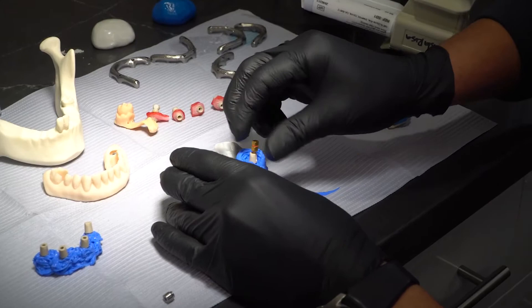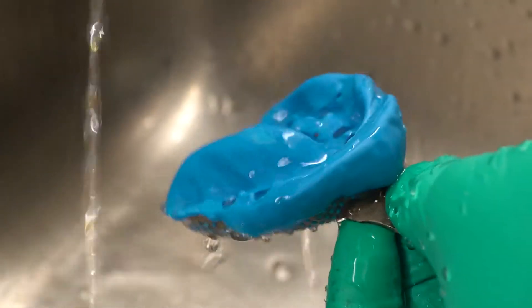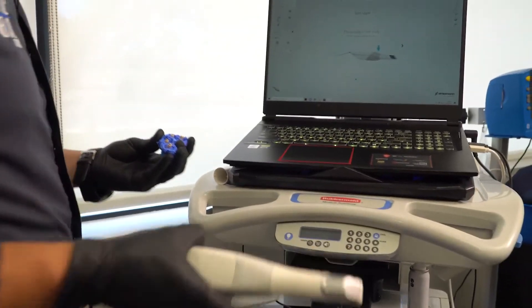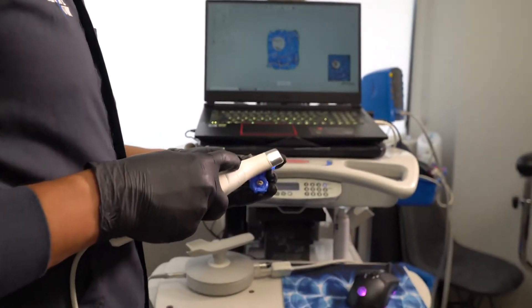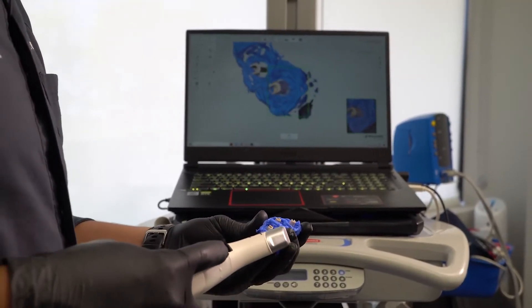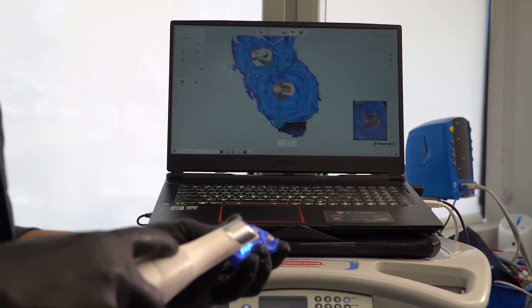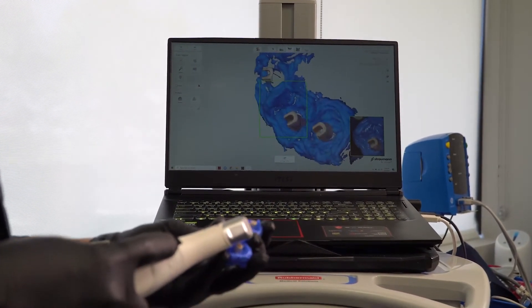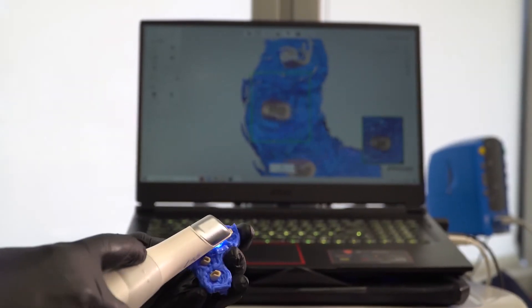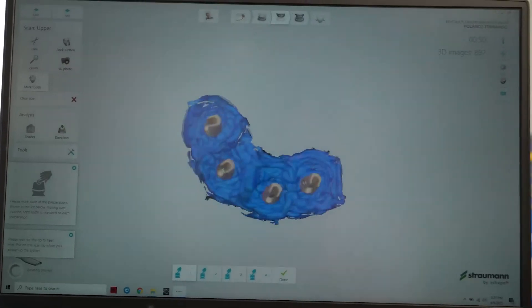Once the material is hard, we make sure that everything is sealed and then we can start removing everything. Now we have the option to scan with a desktop scanner or with your intraoral scanner. I get an air-water syringe and dry this — I want to make sure I don't drop it or squish it. I get my intraoral scanner and follow a path going occlusal, occlusal, occlusal. I never start from the lingual or buccal. Once I capture my occlusal position I leave the scanner there for 2-3 seconds, then move to the other scan body: buccal, distal, lingual, mesial. Then back to the previous scan body: buccal, lingual, distal, mesial. We don't want to be fast — we want to be accurate.